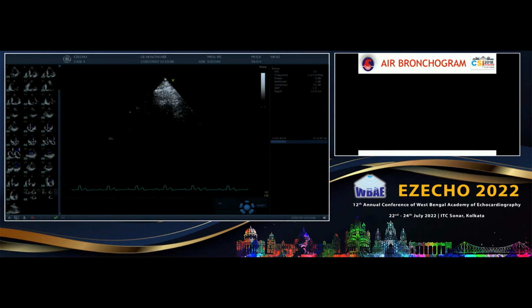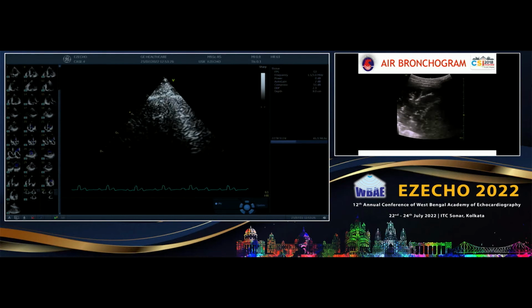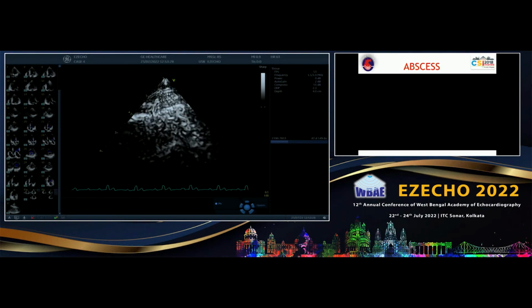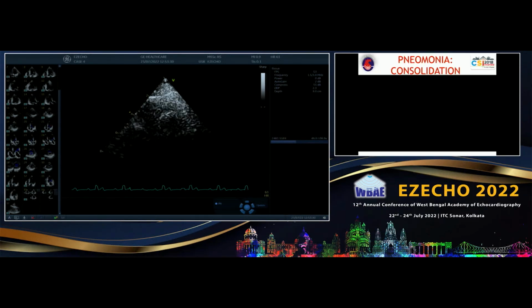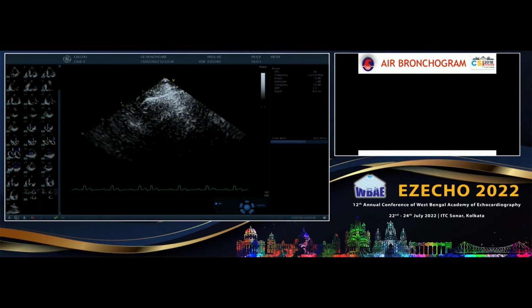So this is the lung line, which lung pleural sliding you are seeing at the top. I will show it with the pointer. See, this is what I have to see. Okay, so what I will do is, I will decrease the depth and make it nearer. And I can also increase the width to have a bigger envelope.